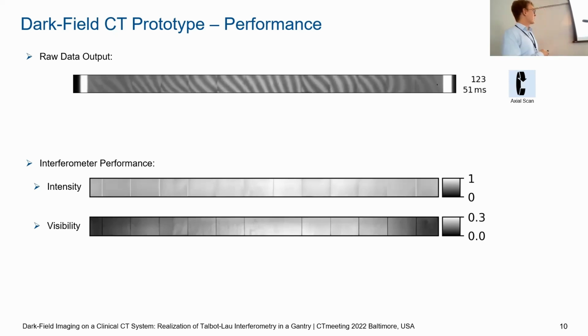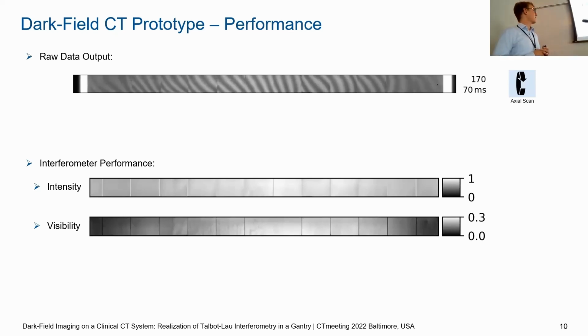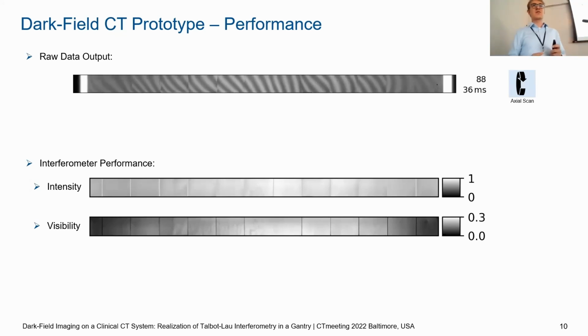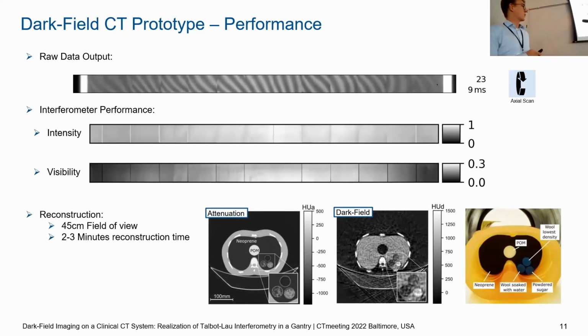But we clearly see to the left and right that the visibility degrades somehow. And there, the visibility does not go to 0 as it's indicated here. It always looks a bit strange on these projectors. No, it goes to like 10% in these outer regions. And this is still sufficient for our tomographic reconstruction, where we can easily compensate for this gradient in the visibility. And I brought for this purpose here a reconstruction of a Lungman phantom, which is basically the chest of a human.